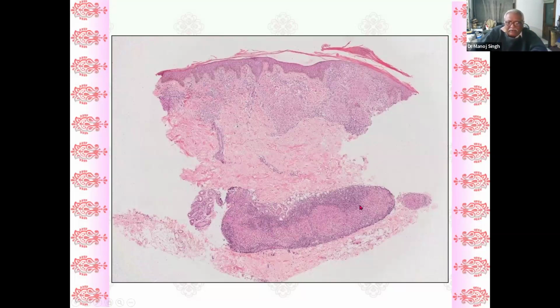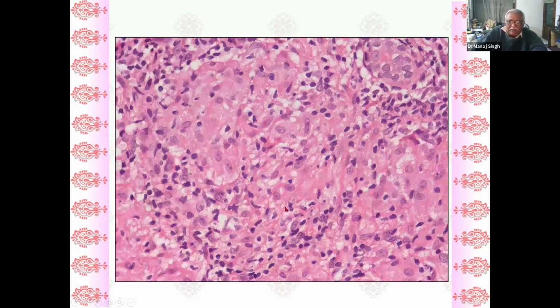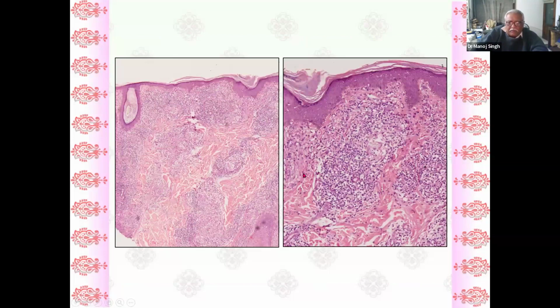And this is a classic example of a BT leprosy. As you can make out in the higher power, epithelioid cells form an organized collection, the granuloma, and lymphocytes are usually present on the outside, but also infiltrating amongst the granulomas.